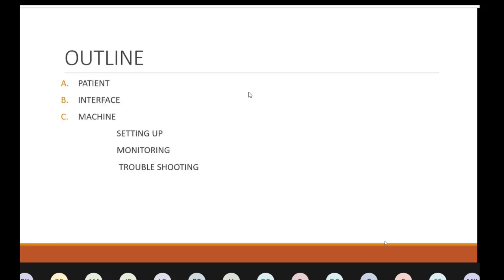Okay. So now about masks. So that was about the patient. What type of patient should we take for non-invasive ventilation? The next thing is what type of mask should we use? The first one that we see is a nasal mask. His mouth is open. This is a full face mask. But then again, the air is high, so it is difficult for the patient. This is a helmet that we do not have. It's not available for us, so we are not commonly using it.